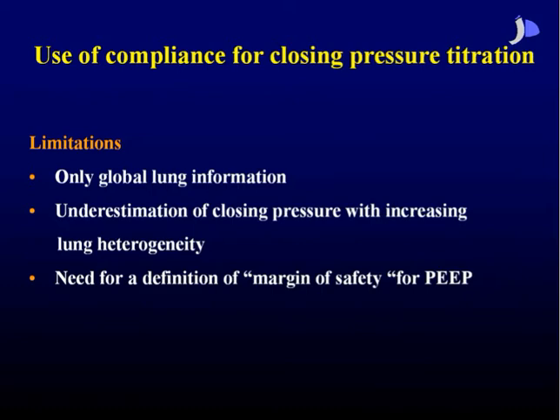There are some more questions, but we'll have to do with a final question, please. Barry Lyons from Ireland. Do you think you could recruit using lower pressures if you change the patient position? Say if you turn them prone, maybe you could recruit without needing pressures of 65? Yeah, I think there could potentially be a synergistic effect by turning the patient prone, especially not by the recruitment itself, but probably by the PEEP level you need to apply to stabilize the lung.